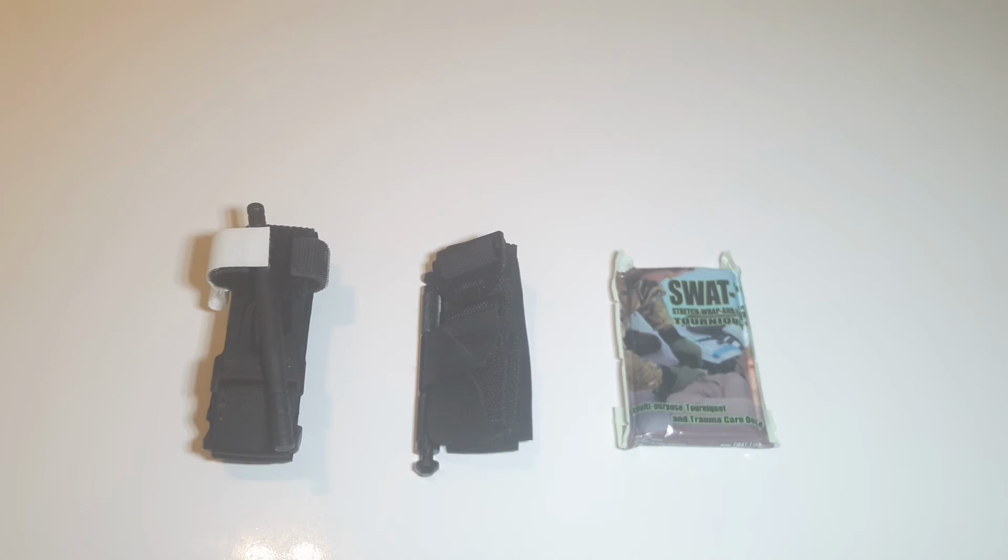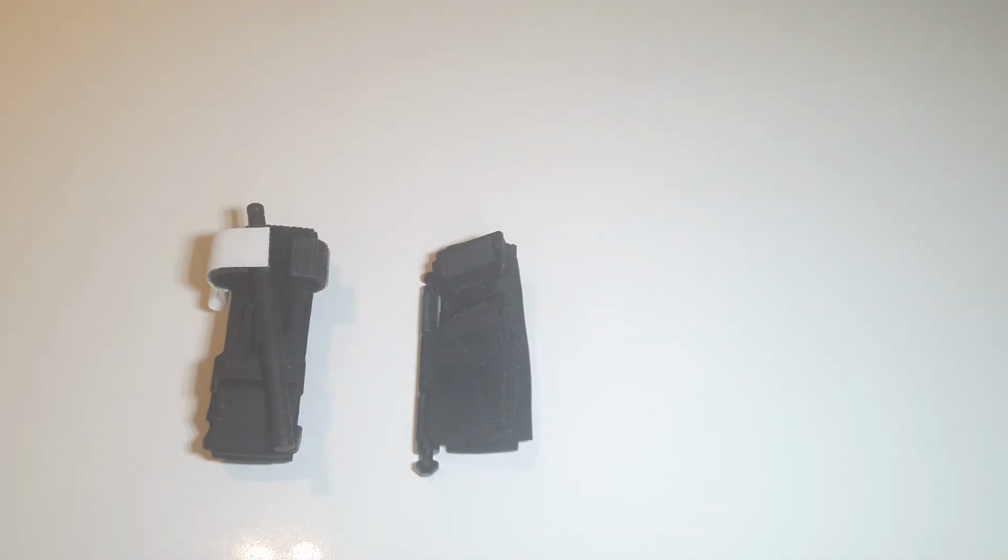Its major con is that it's not the easiest to apply one-handed. It also has a finite shelf life of up to 10 years if kept in optimal conditions. It's also surprisingly the heaviest of the three. Its target market is for law enforcement and SWAT officers, so there could be a lot of data that proves it actually works. I just haven't come across any yet. If someone can link to that info, I'd appreciate it.